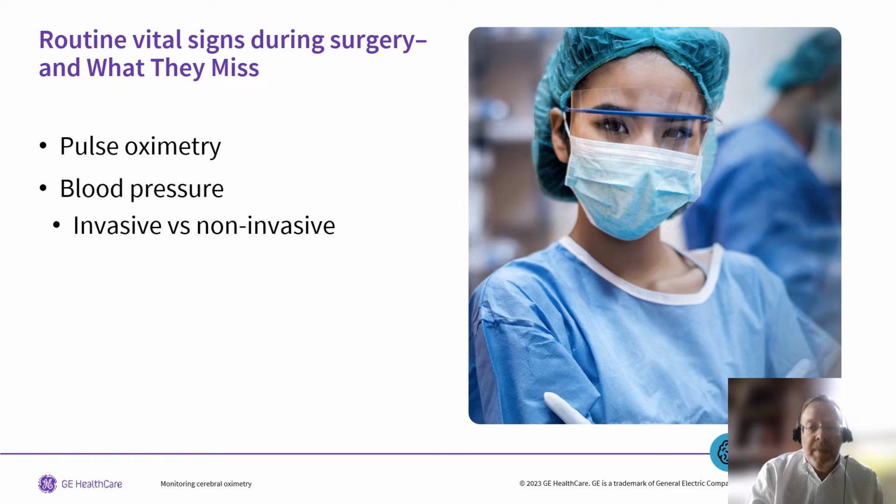Also, when you talk about non-invasive blood pressure cuffs, the inflation frequency may also have to be adjusted to counteract the effect of non-invasive blood pressure on IV flow. When it comes right down to it, non-invasive blood pressure is also really a surrogate measure. It's a surrogate measure of cardiac output and flow, but it can be misleading under various clinical conditions.